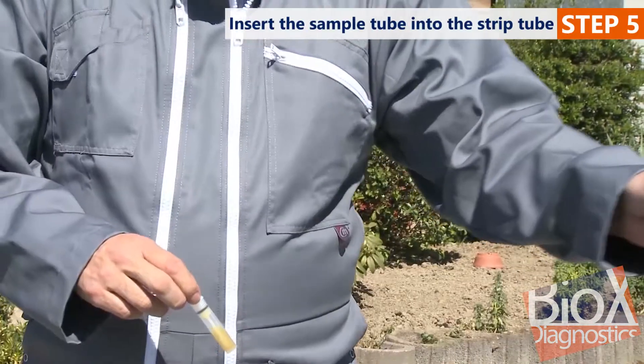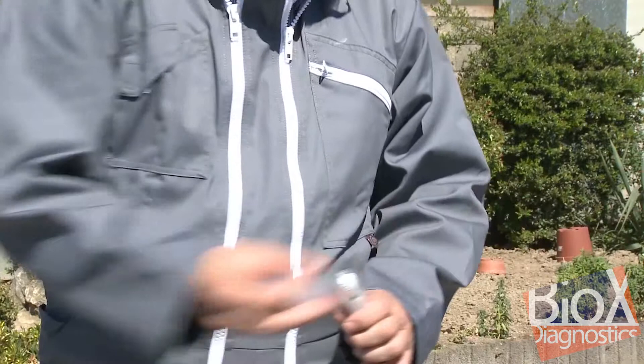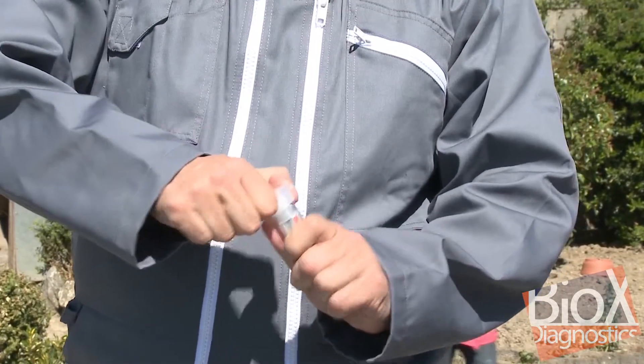Next, slide the small specimen tube into the large immunochromatography strip tube and screw the cap on tight. Two sharp clicks must be heard, indicating that the holes at the top and bottom of the specimen tube have been punched out.